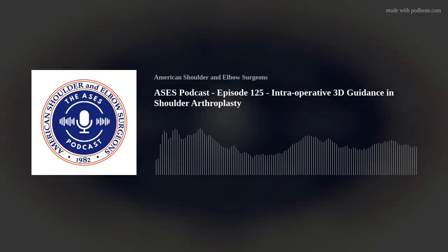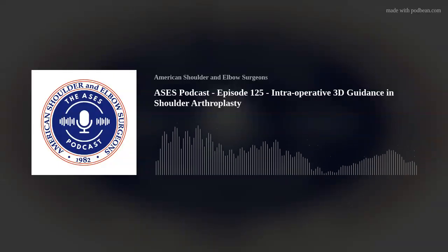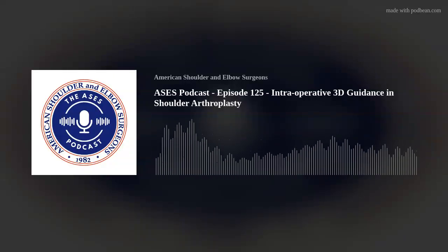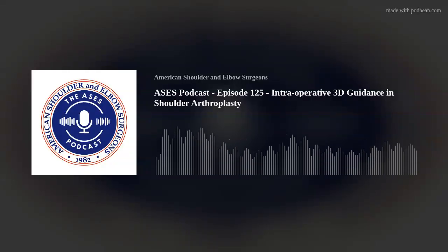But if you have all those issues and you identify that, navigation, I think, adds another element. And I said I do both because I also want to guide my humeral side as well, which I do with PSI. I think robotics is a really interesting phenomenon, but there are lots of elements to, even with navigation at the moment. One of the things I'm concerned about is those pins in the coracoid and whether that'll cause fractures and those things that concern me.